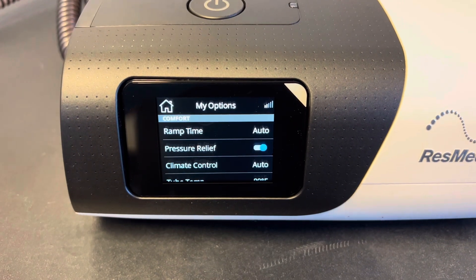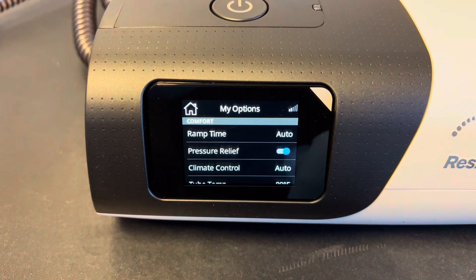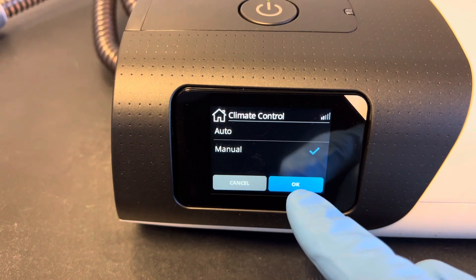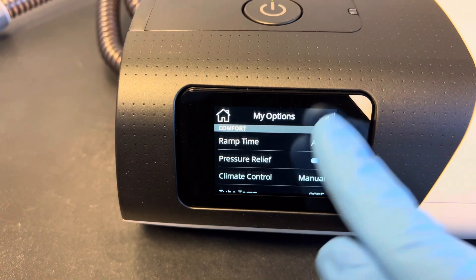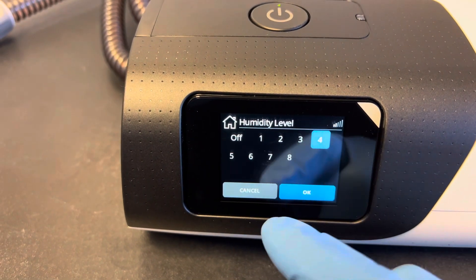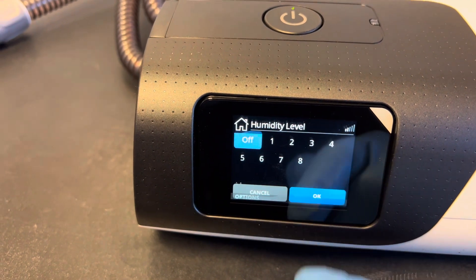That's plugged in now — it says climate line connected. Here you see climate control, so you have to click on climate control, click manual, hit OK, then swipe up and there's humidity level again. Click on that, switch it off, and press OK, and that will turn off the heat plate that's inside the machine.